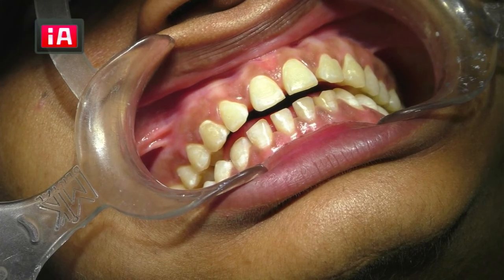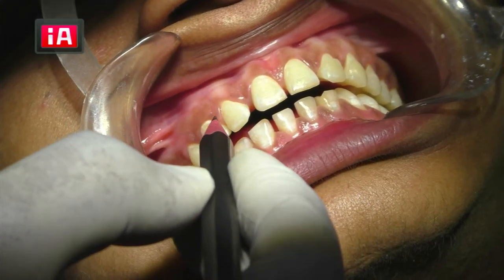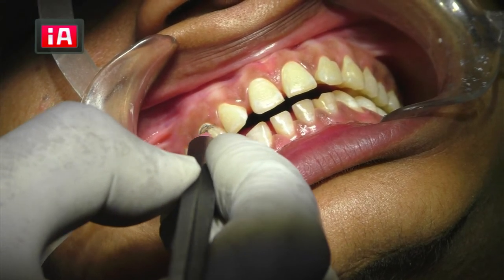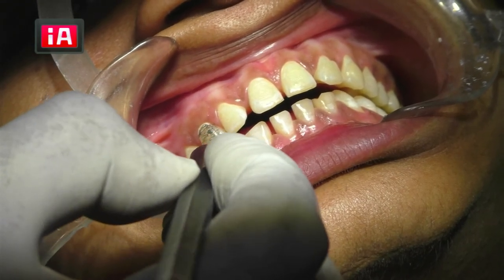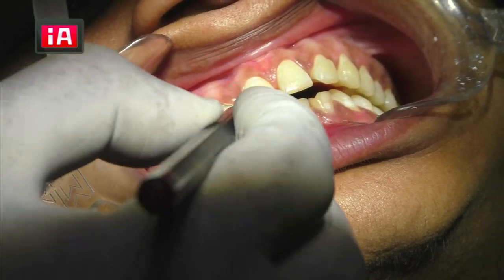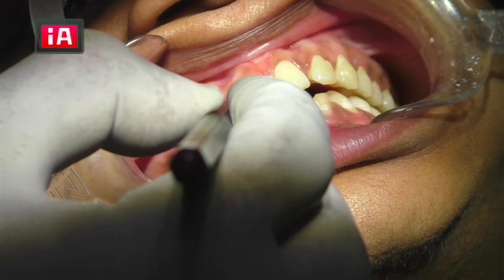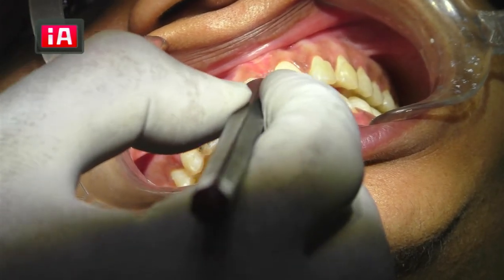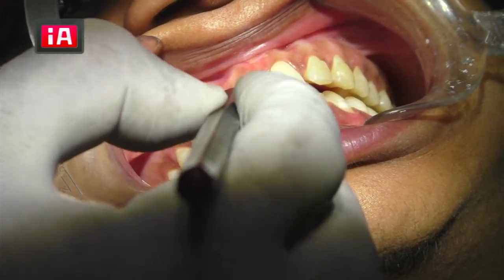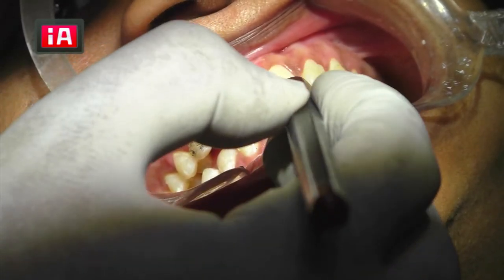So first, to control the preparation, I will mark the teeth with a graphite pencil, so I'll get an idea of how much I'm going to cut. I'll mark canine to canine with the graphite pencil. All the teeth I'll mark. Slightly, I can feel the cement of orthodontics used to bond the bracket. This is rough here.